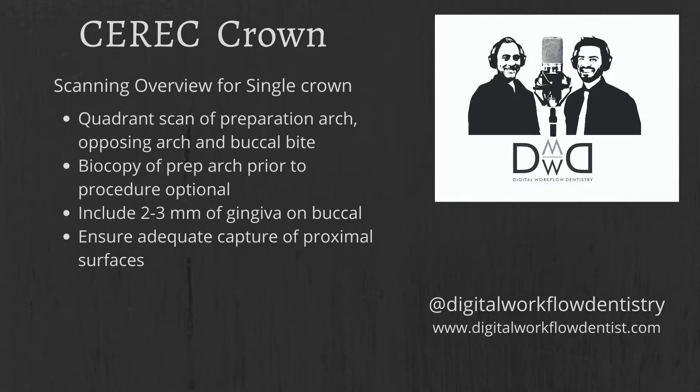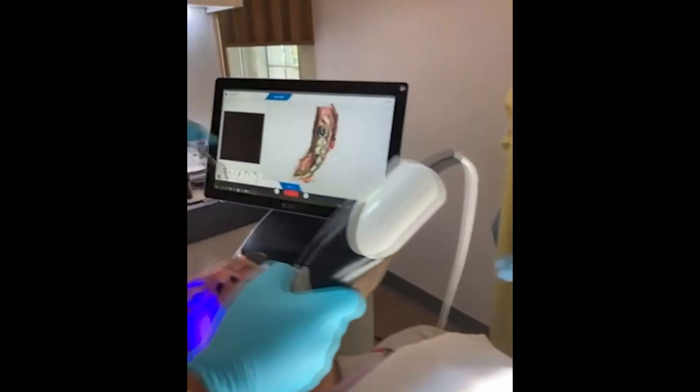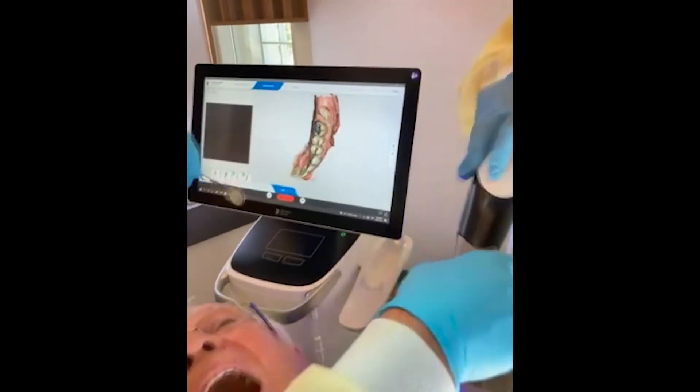When scanning for a single crown, we want to get at least the quadrant of the preparation arch, the opposing arch, and the buccal bite. Biocopy can also be done if you're trying to match an existing crown. Include at least two to three millimeters of the gingiva and ensure adequate capture of the proximal surfaces. Here we're scanning our patient, getting imaging of the upper, lower, and the bite.